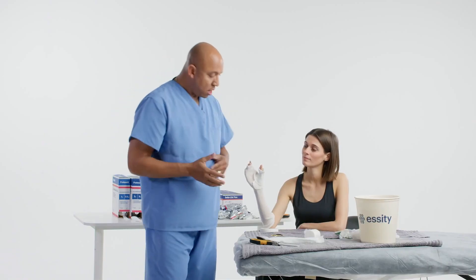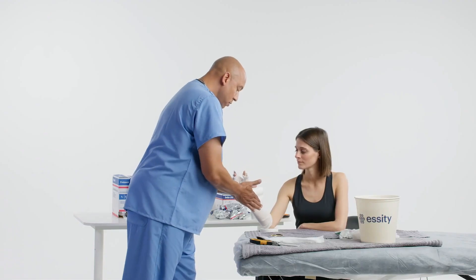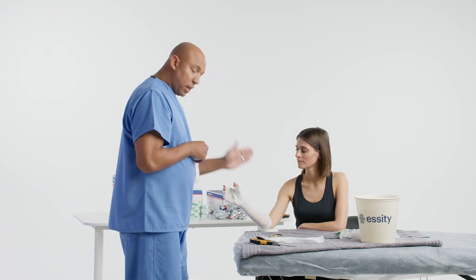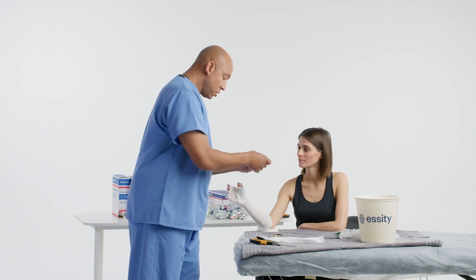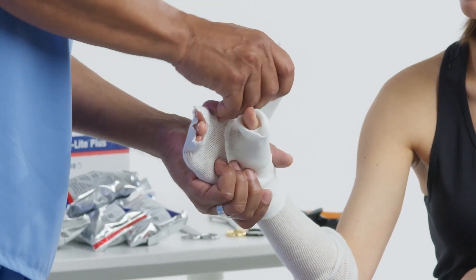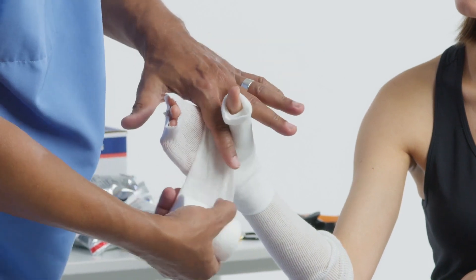Now we're going to add our padding. The padding roll is going to be up like a snail — we're going to start at the wrist, go to the hand, and then work our way to the forearm. I'm standing directly in front of the patient so I can see all the different planes of the extremity. Start on the wrist, go to the hand immediately. I can shrink the padding down and hold on to it to make it a little bit more narrow to go through this web space.